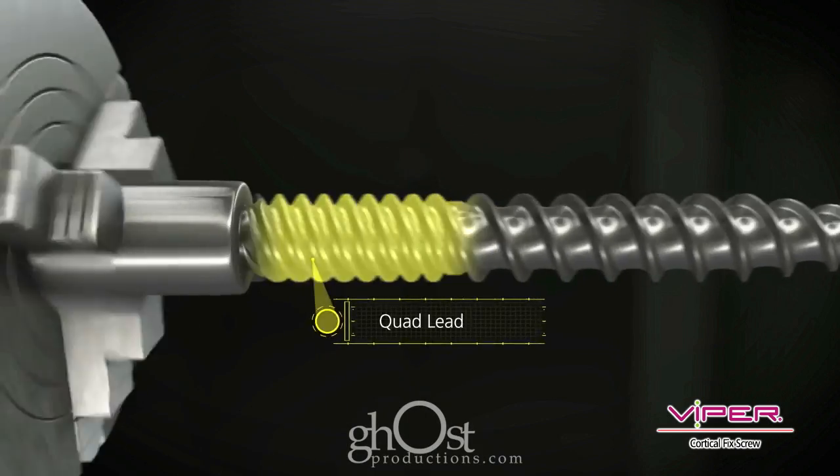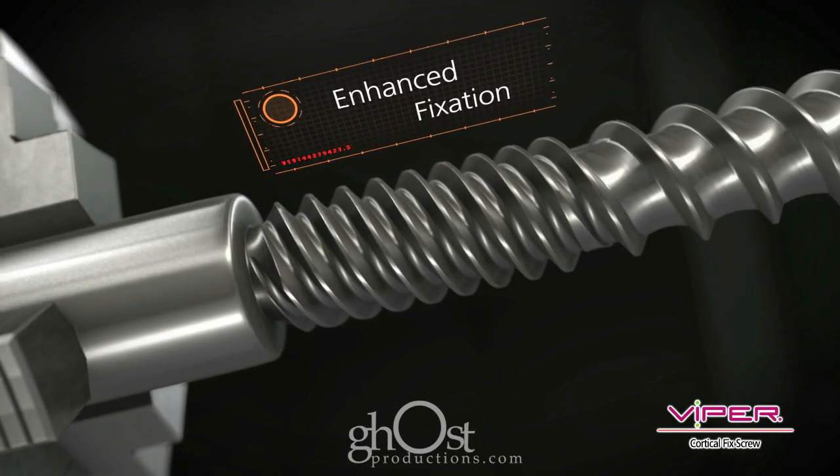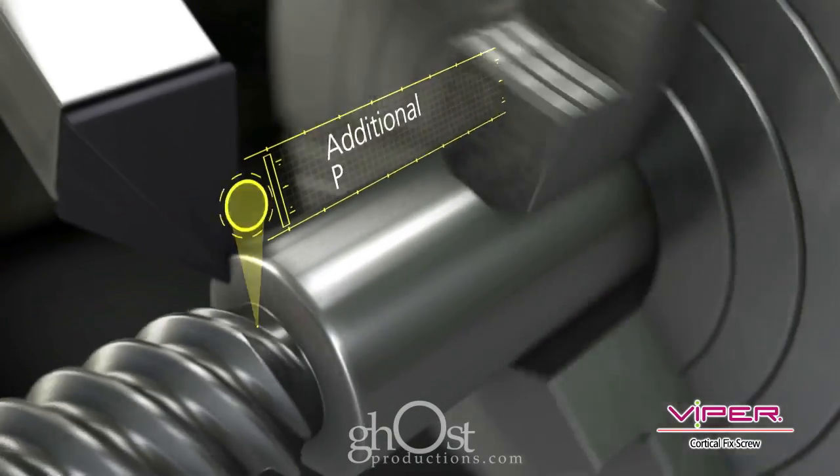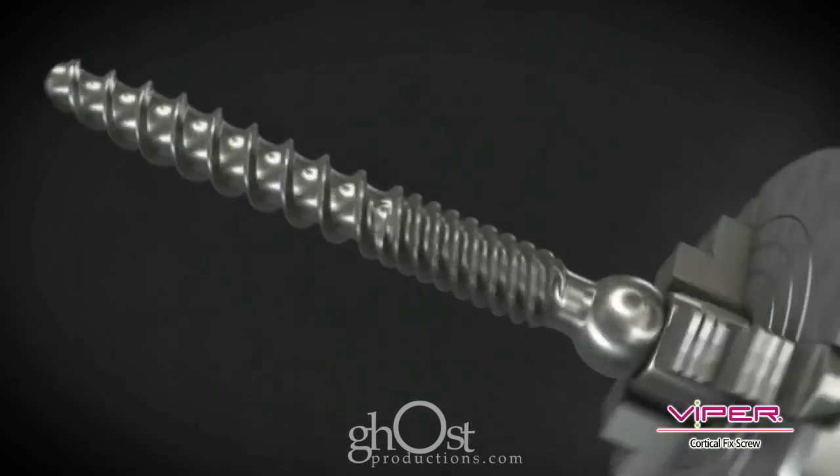The unique quad lead thread form extends 18mm from the top of the screw shank and is designed to provide enhanced fixation. Additional proximal threads allow for engagement of more posterior bone.